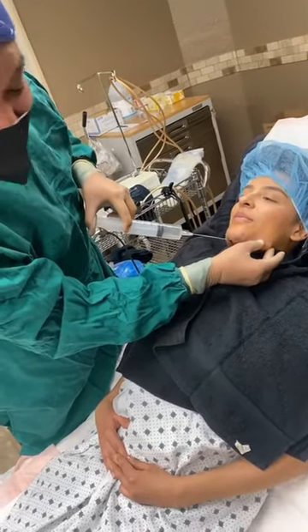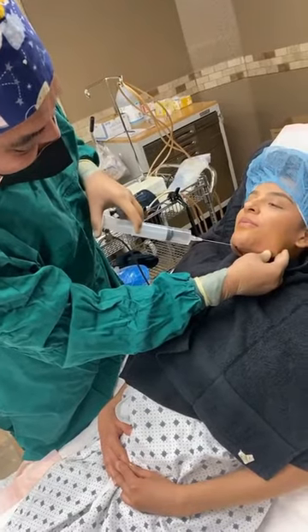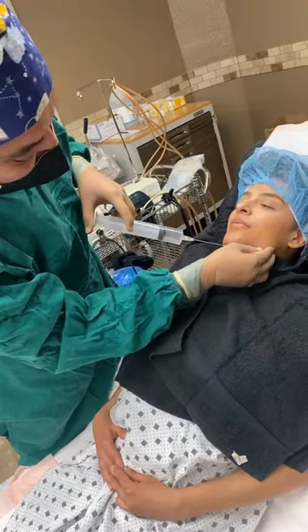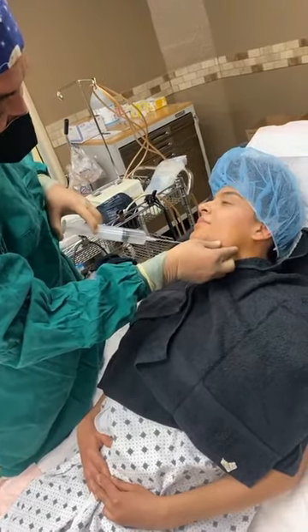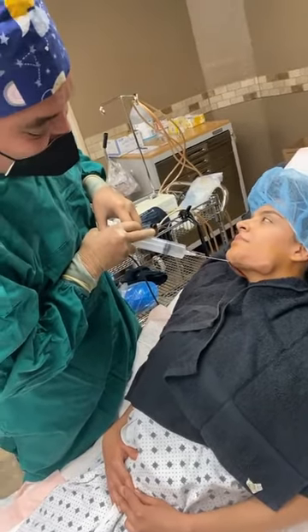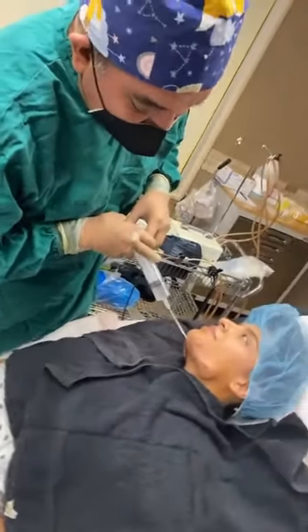This doesn't hurt. Now remember, I'm going to be liposuctioning here, so you definitely want to make sure that you turn your chin this way, and that we're not going too deep in the tissue.